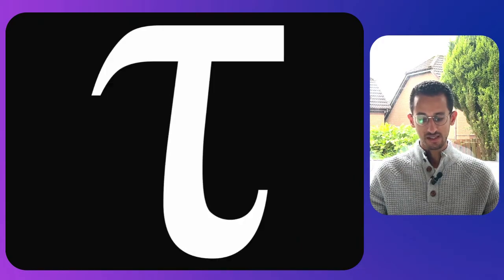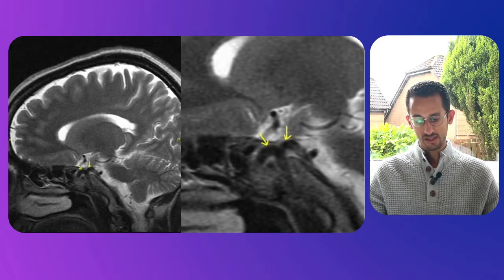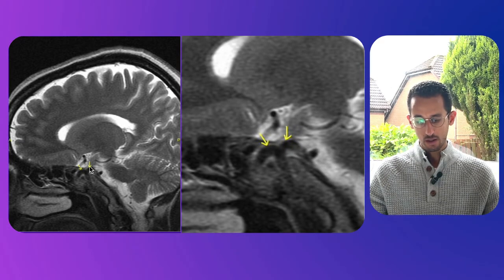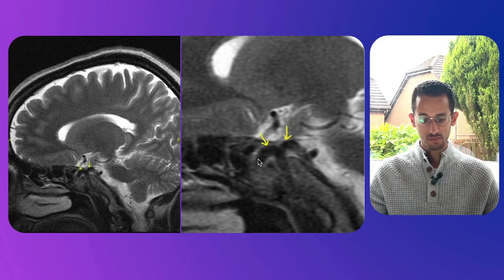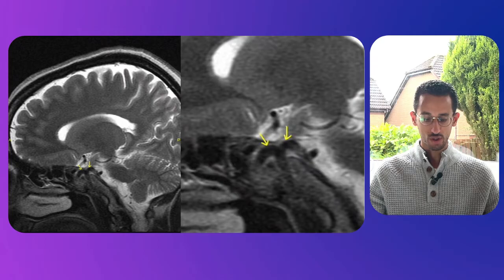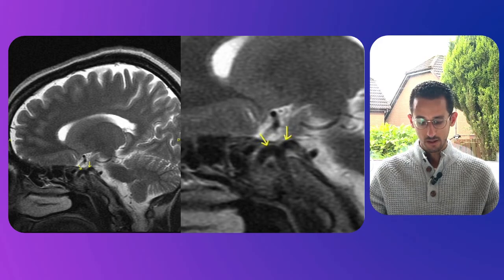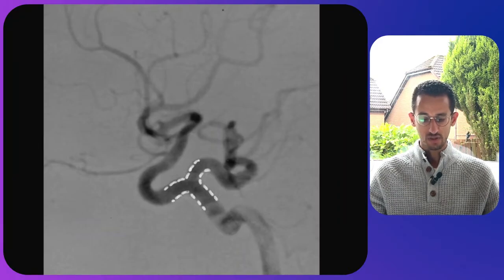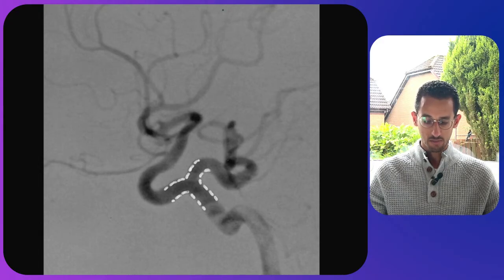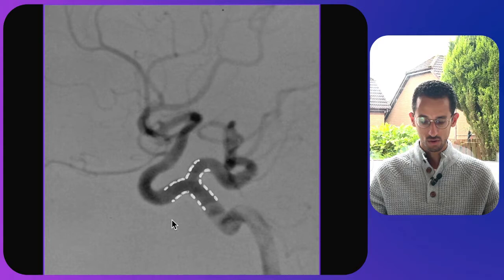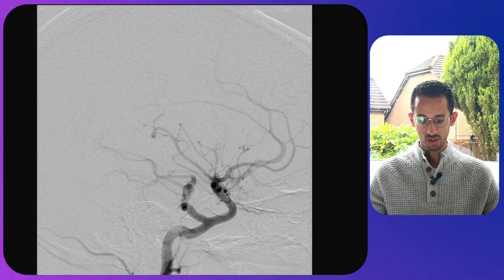The next sign is the tau sign. You can see it on this MRI scan — a T-shaped or tau sign — and this represents a persistent trigeminal artery, also called a persistent primitive trigeminal artery. It appears on the sagittal MRI or MR angiogram. You can also see this shape clearly in cerebral angiography, where the tau sign is obvious in a persistent trigeminal artery.